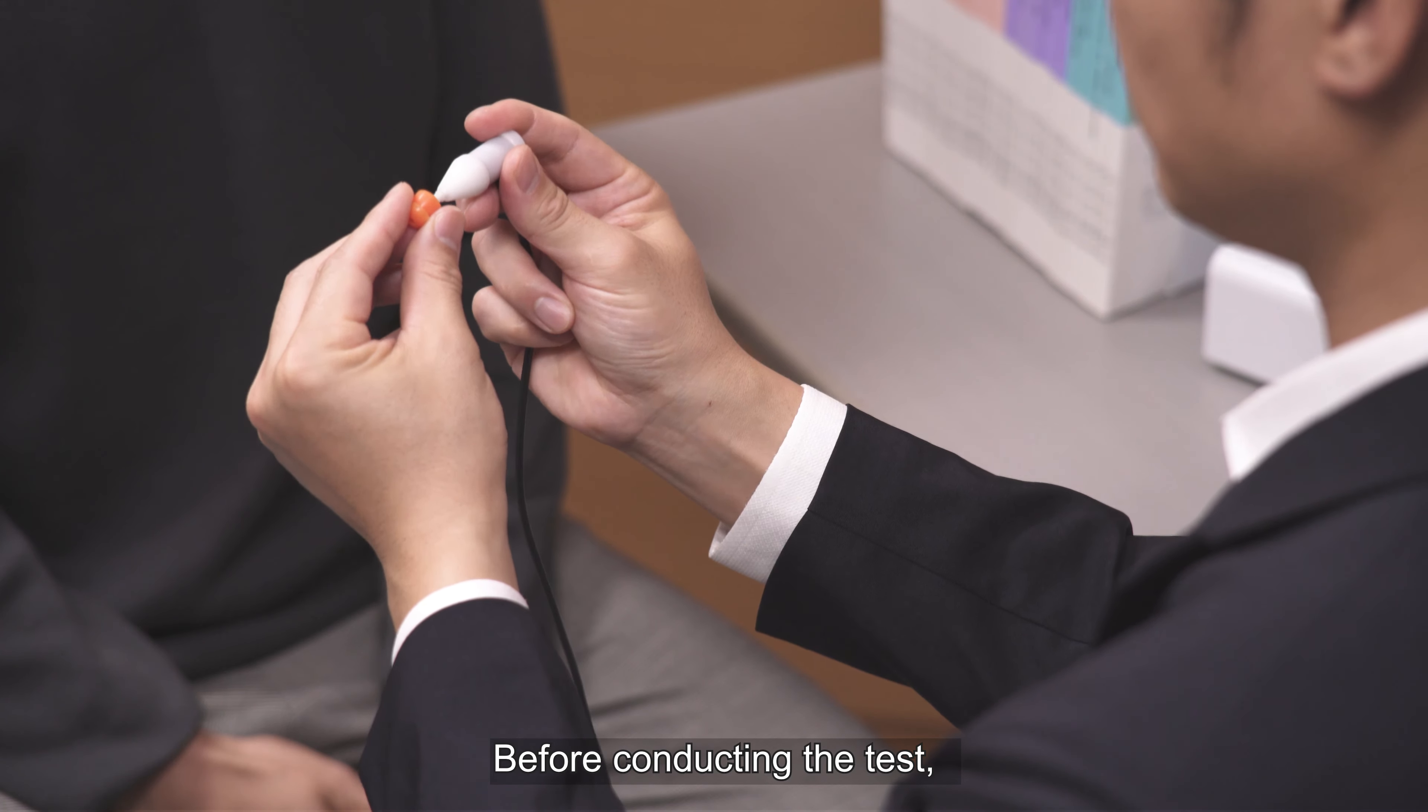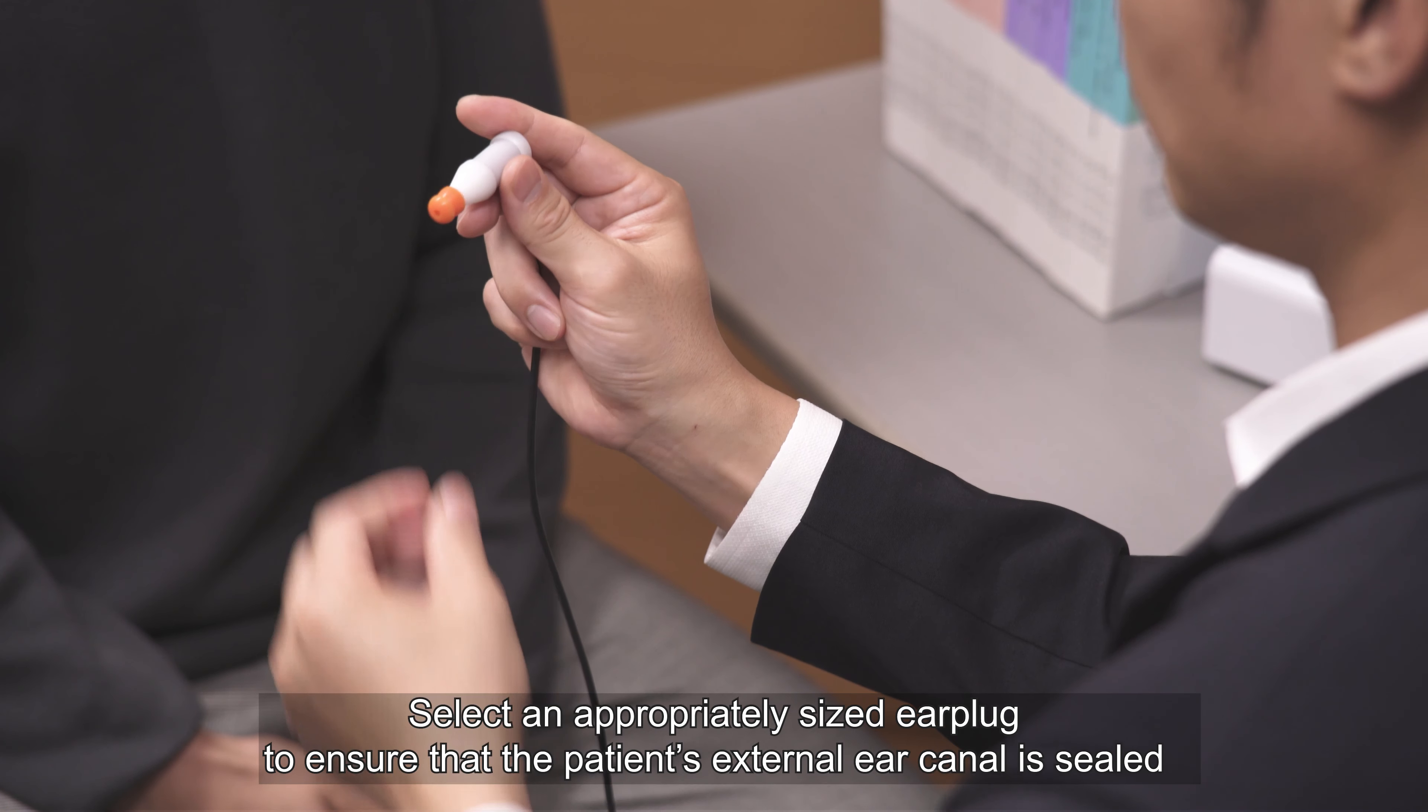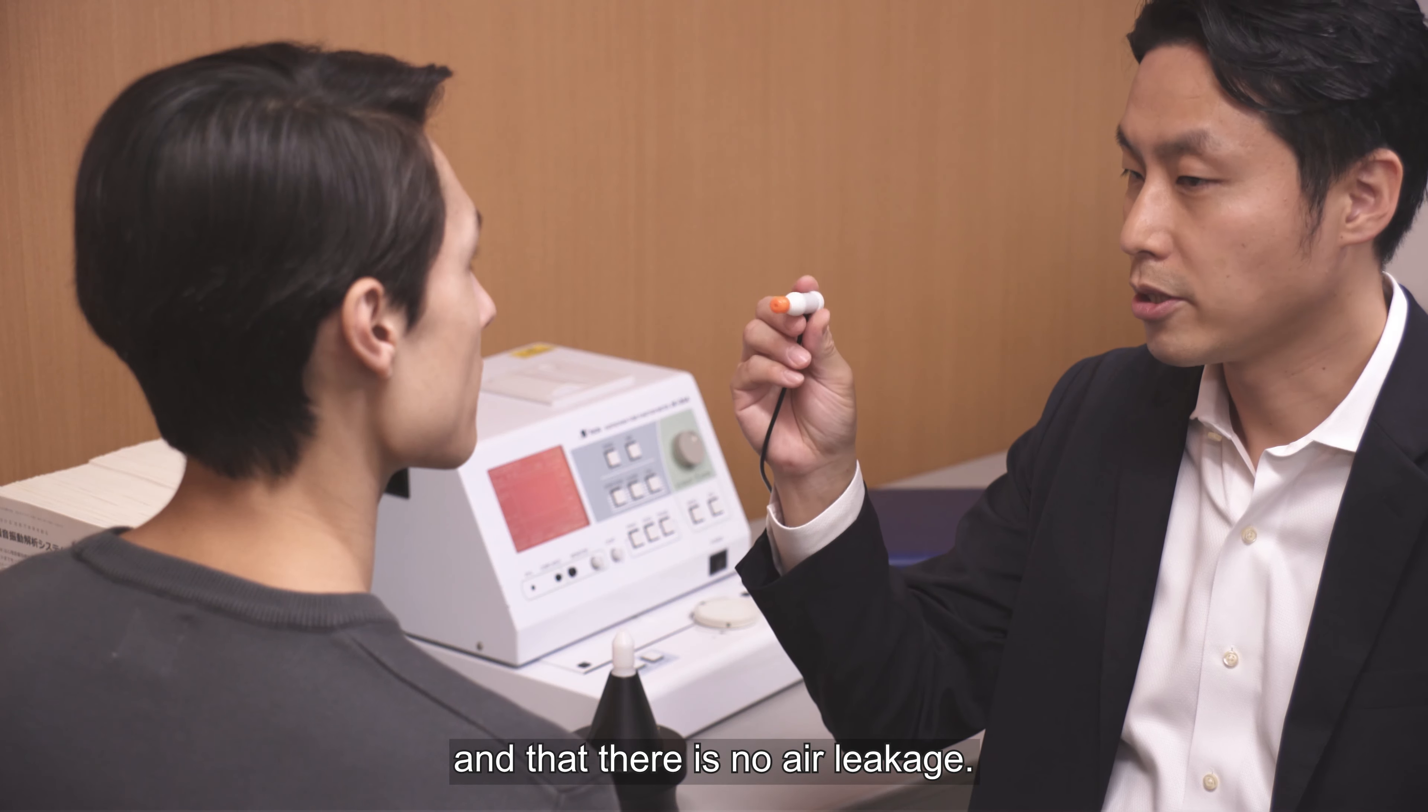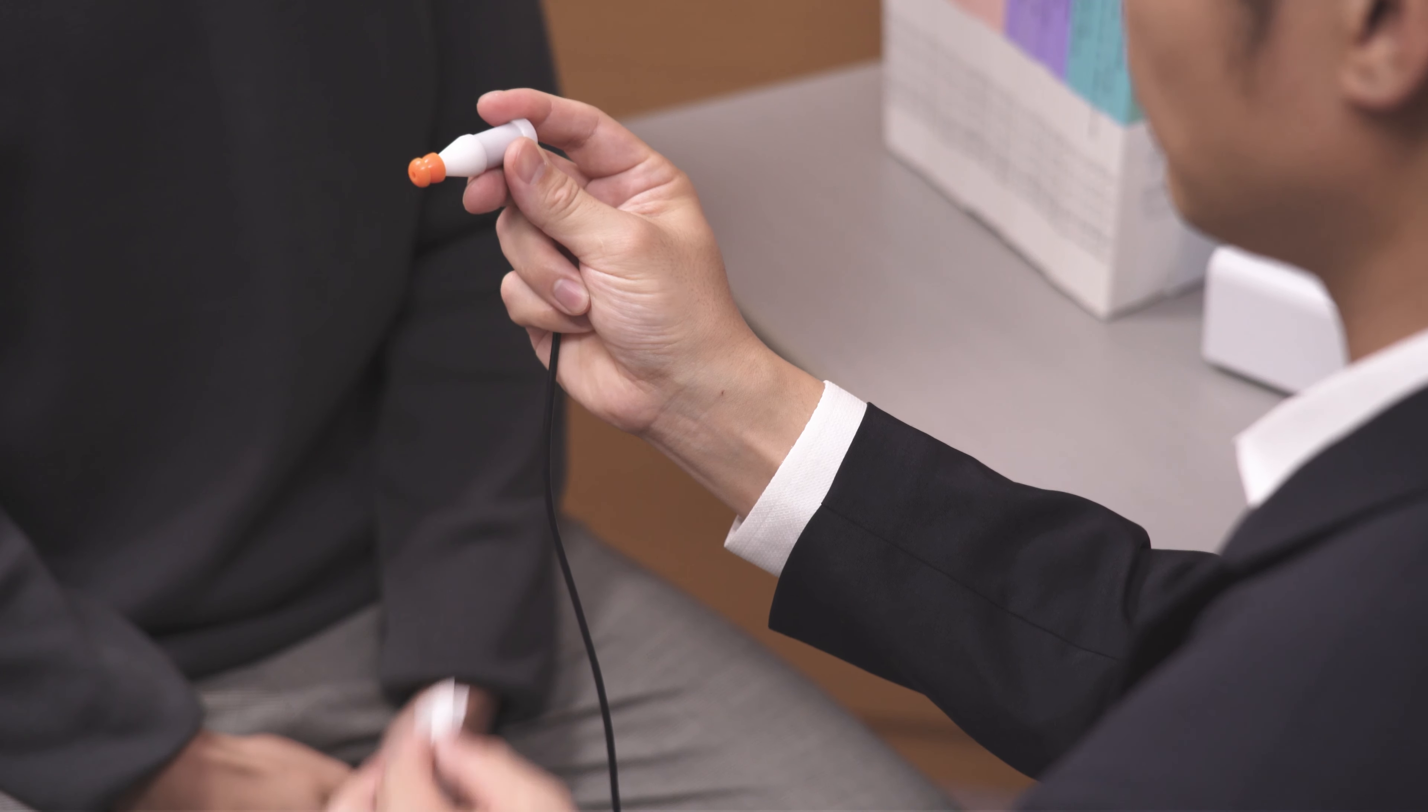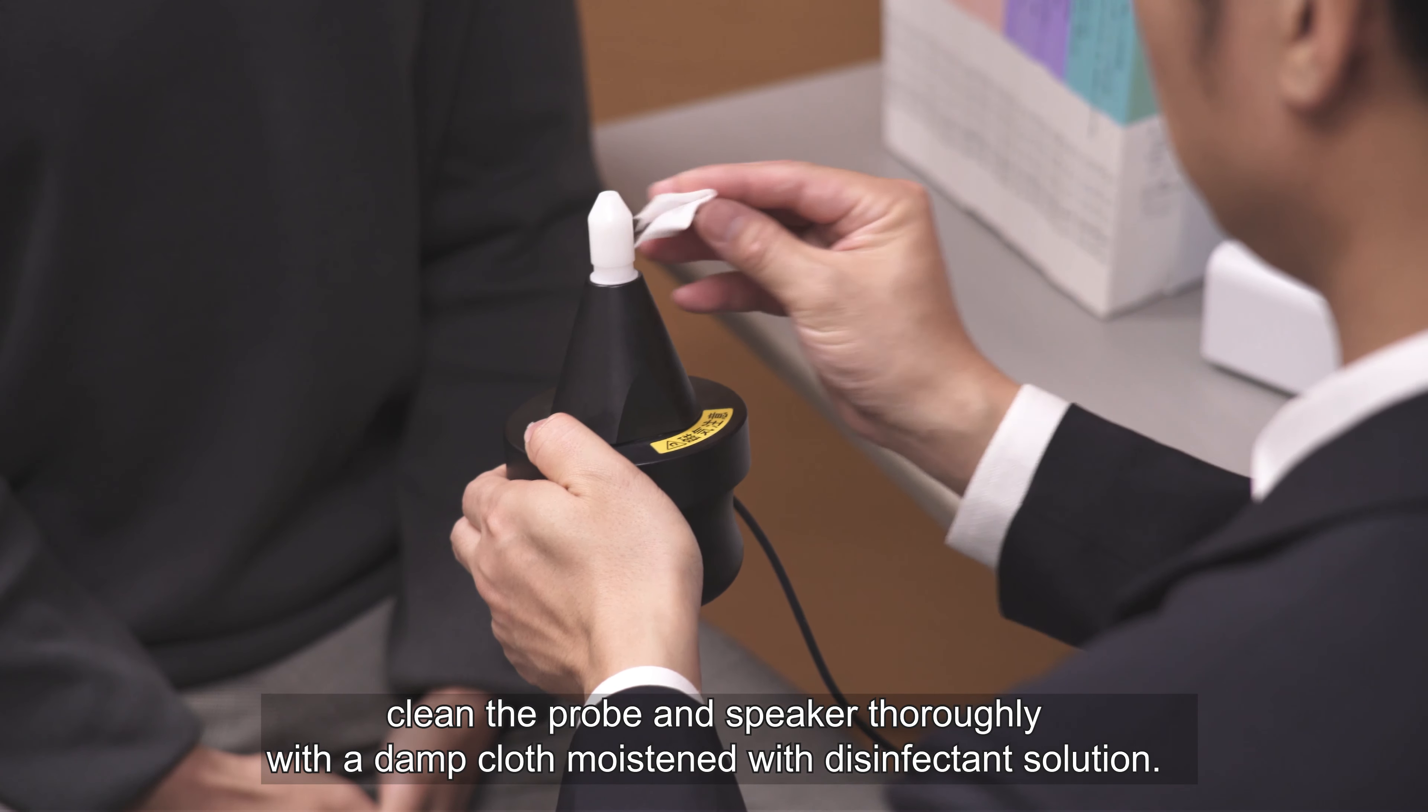Before conducting the test, select an appropriately sized ear plug to ensure that the patient's ear canal is sealed and that there is no air leakage. Clean the probe and speaker thoroughly with a damp cloth moistened with disinfectant solution.